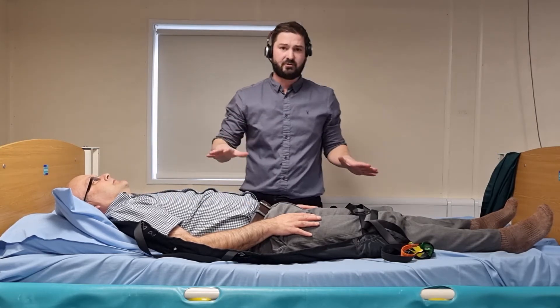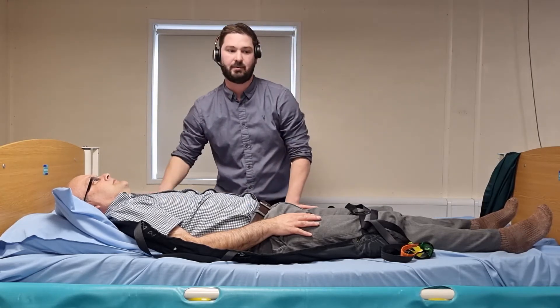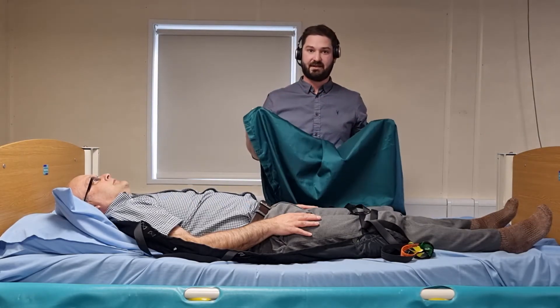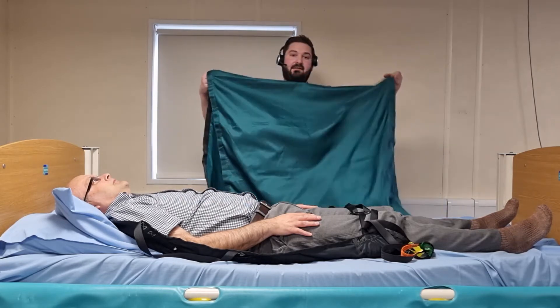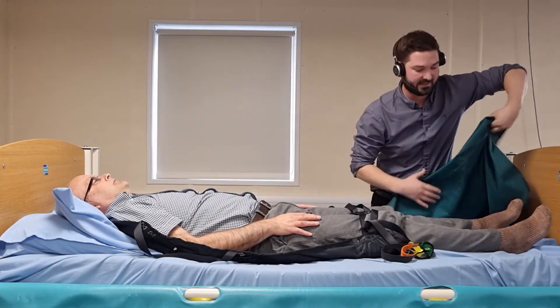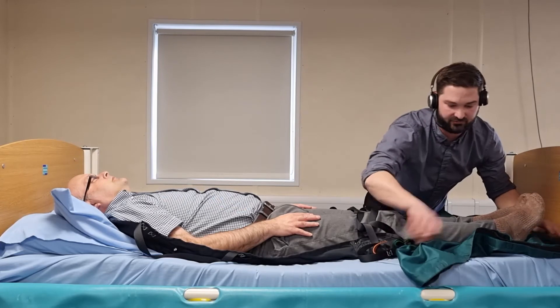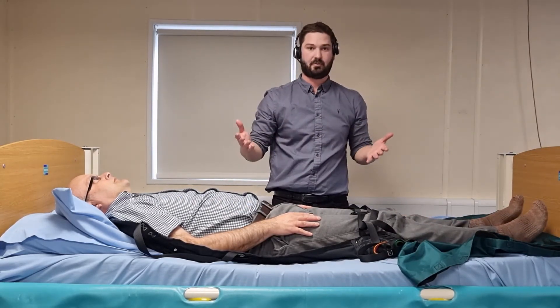Another visual check just to make sure that while fitting the lower part of the sling I've not misplaced any part of the top. I'm then going to fit a flat slide sheet underneath his lower limbs — a single flat slide sheet folded in half, placed underneath his heels. This is to reduce the risk of shear friction forces on his lower limbs while being hoisted up off the bed.